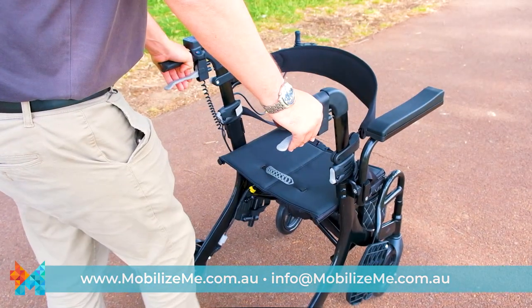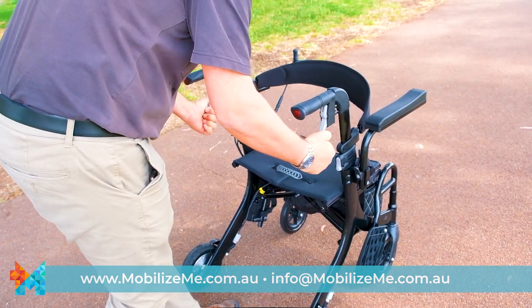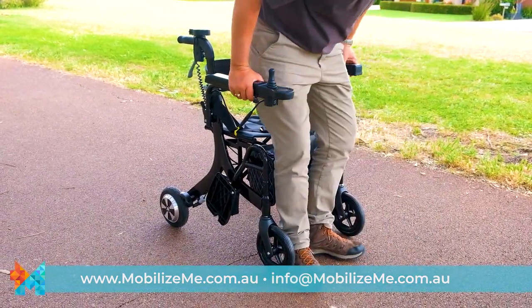Converting the Evo from a rollator to a push-assist wheelchair or electric wheelchair couldn't be easier. Ensure your manual brakes are engaged, flip the backrest over and swing your footplates into place.